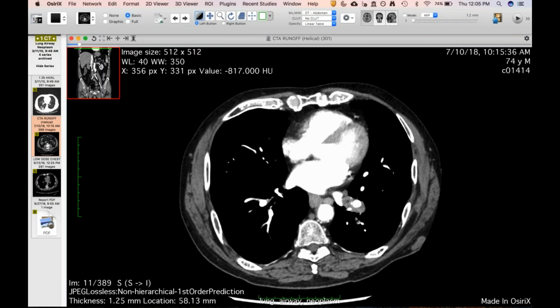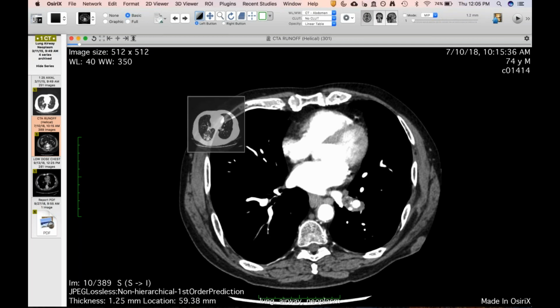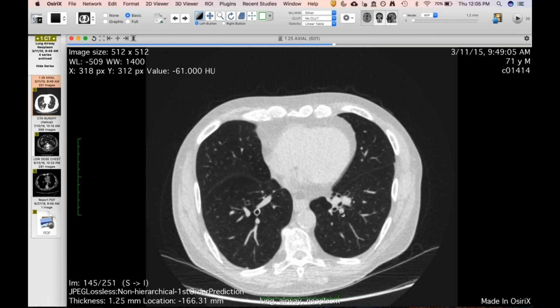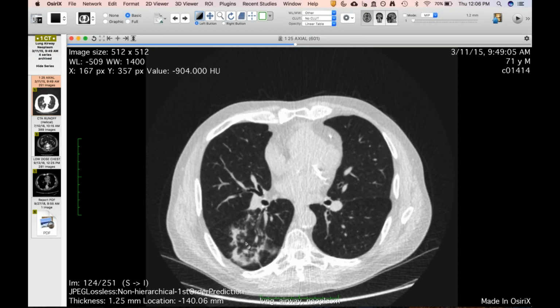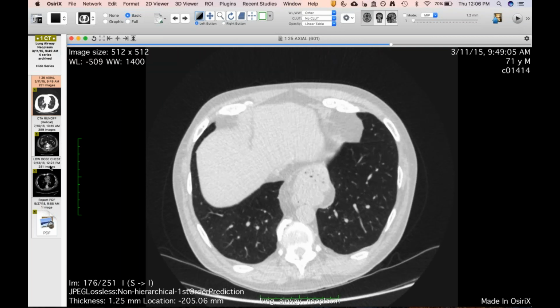And maybe here we can see that there's not really a discrete mass. There certainly could be a small mass obstructing this. But based on that, they were worried about cancer. And I'll show you, going back to a CT he had in 2015, that there certainly wasn't a nodule back then or anything in the bronchus. But he did have another clue, which was on the right side. He had some little centrilobular nodules and a little nodular consolidation in the other side. And he has a big hiatal hernia.